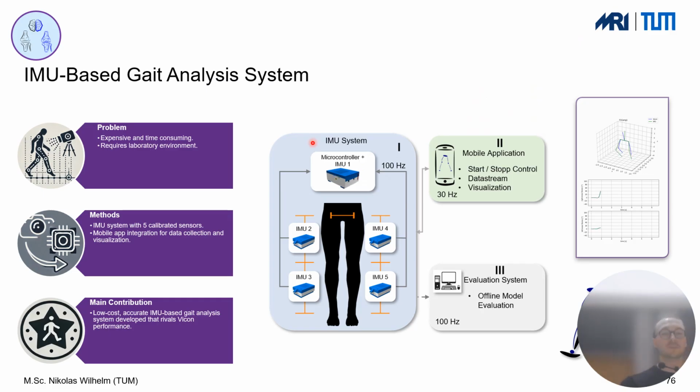So one system I developed was, for example, an inertial measurement based system with 5 different IMUs. The goal was to measure the human gait in this case. So yeah, IMUs were the best way to go here. Then how do we display everything? How do we calibrate everything?